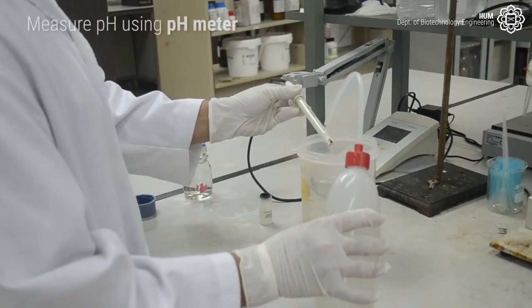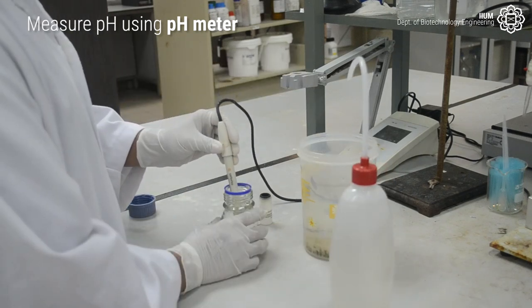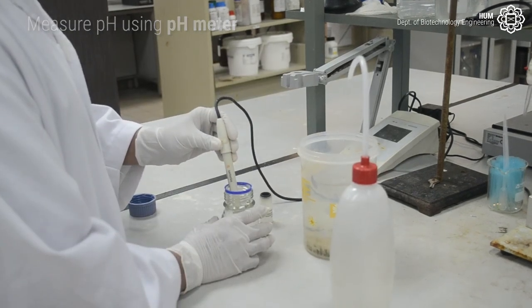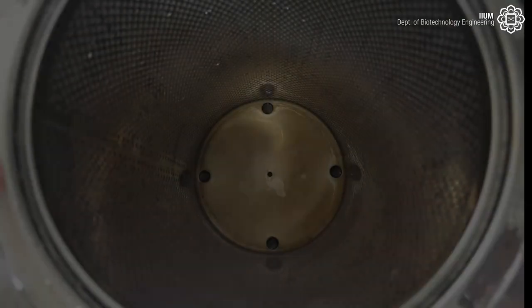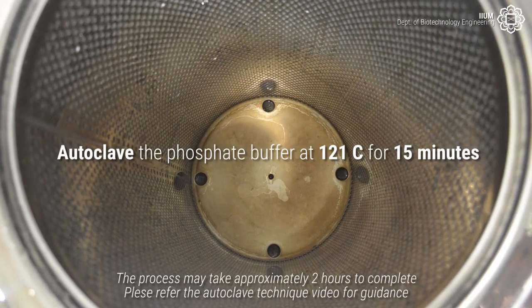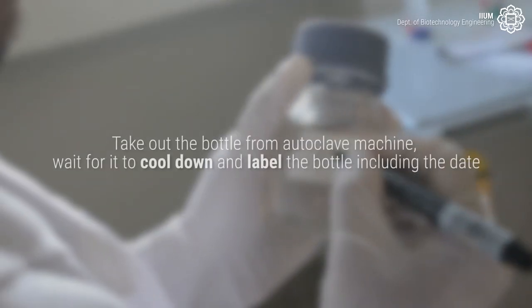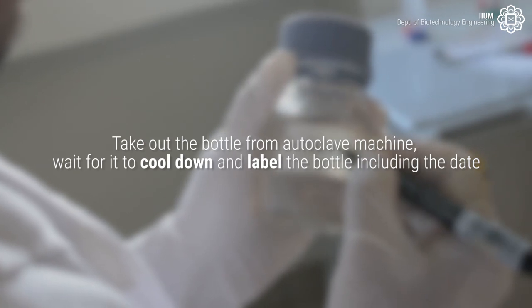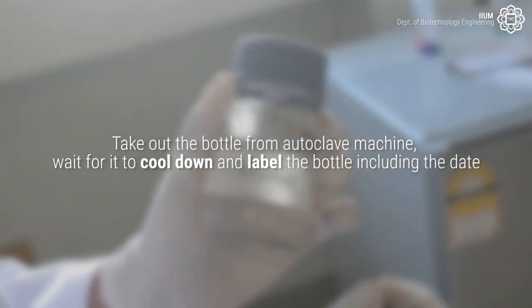Measure the pH of the phosphate buffer using a pH meter. The correct pH for phosphate buffer is between 6.5 and 7.5. Take out the shot bottle from the autoclave machine, wait for it to cool down, and label the bottle including the date.